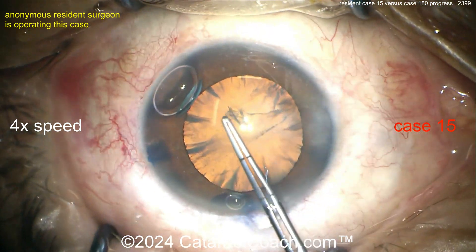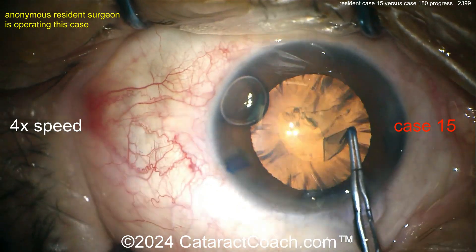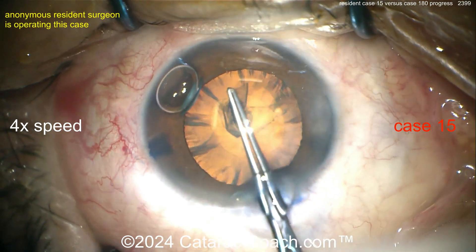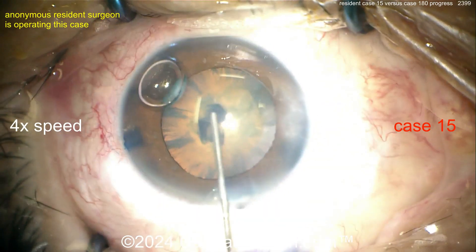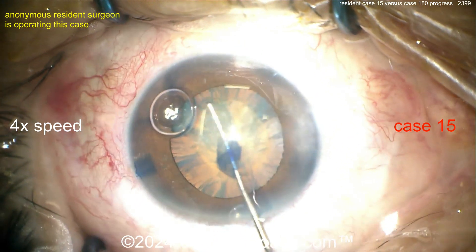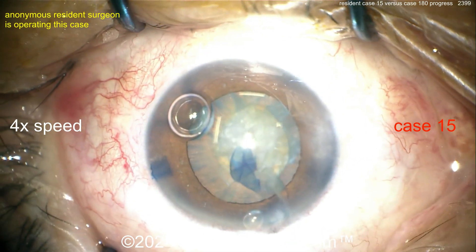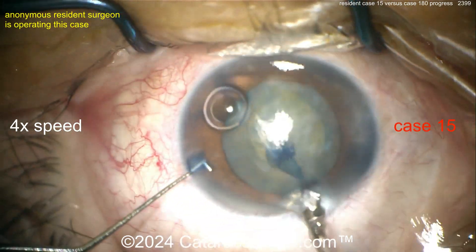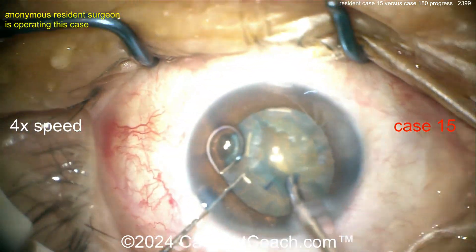Now going with forceps — if you're just doing a forceps to poke in the capsule, that's fantastic, and you've got forceps marked off at two and a half and five millimeters. That rhexis looks a little small — it's a little bit of a baby rhexis. Remember, cataract coach always tells you: no baby rhexis. For case 15 it's understandable. The left side of that rhexis is too small. A baby rhexis is your enemy as a beginning surgeon — it makes surgery so much harder.